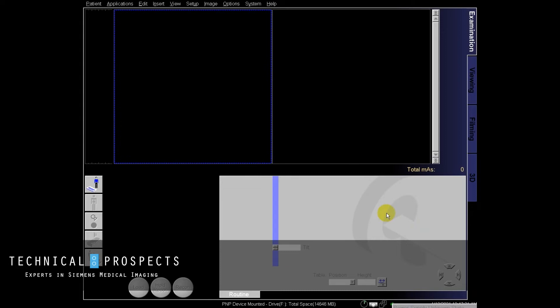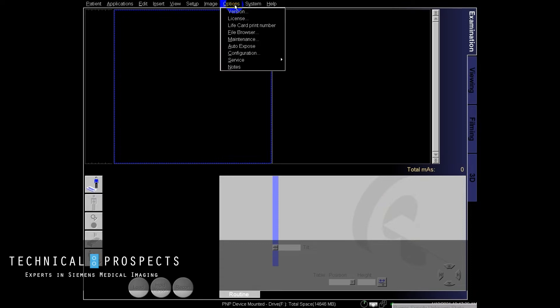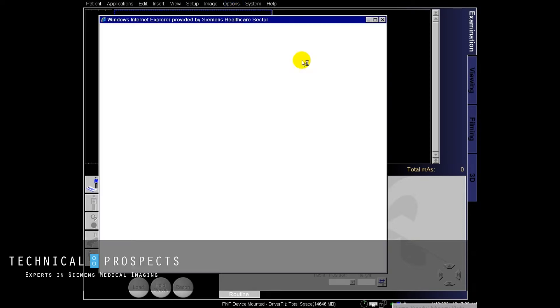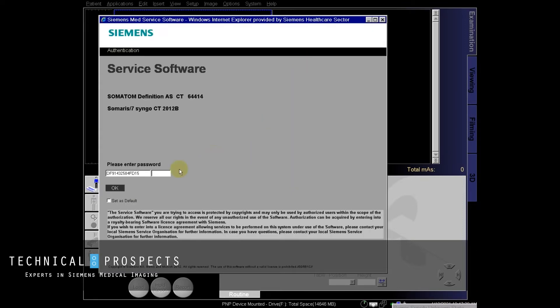Accessing our service files for our CT tube on a Siemens CT scanner, we'll go to options, service, local service, then we'll enter our service key.